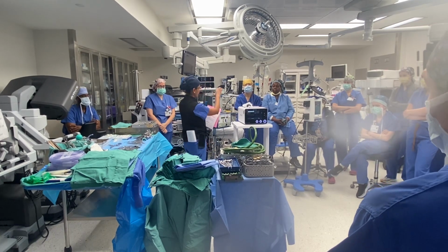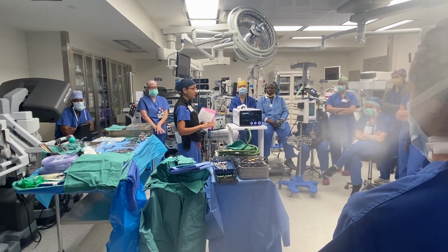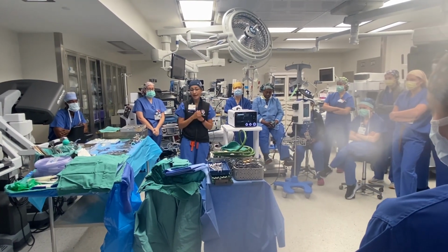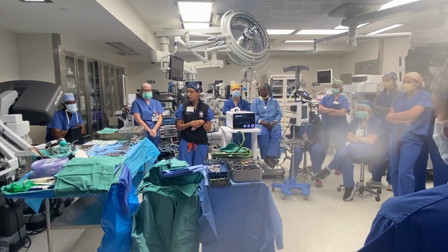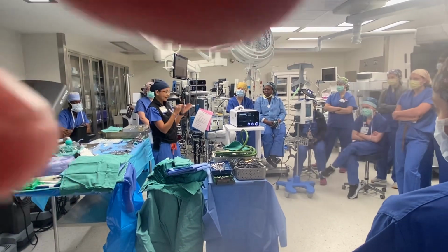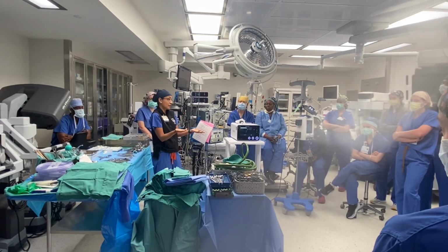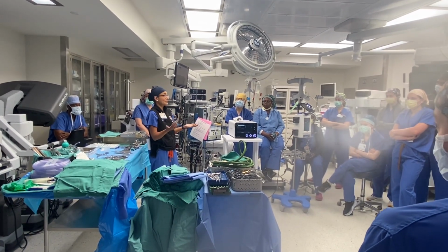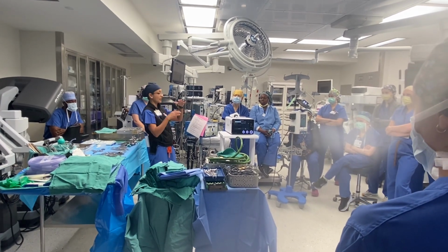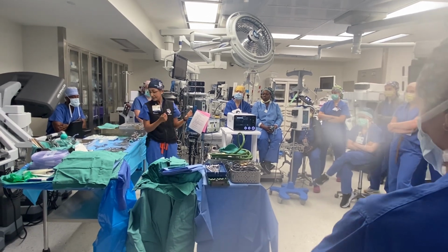So at this point, you'll hear us usually talk to anesthesia, make sure that we get the intracranial pressures down. And so the things to do at this stage are think about, okay, what's going to happen intradurally? So when we're intradural, typically now we're going to use, generally speaking, finer equipment. All sort of depends on the indication for the case. So for example, if it's a big subdural hematoma, that means there's going to be a big blood clot squashing the brain underneath that dura. So we are going to quickly want to take that out.